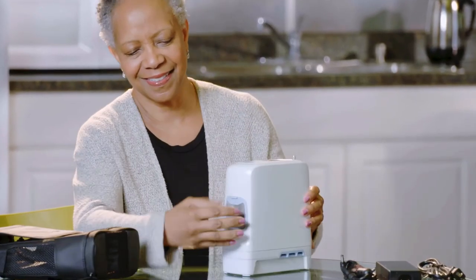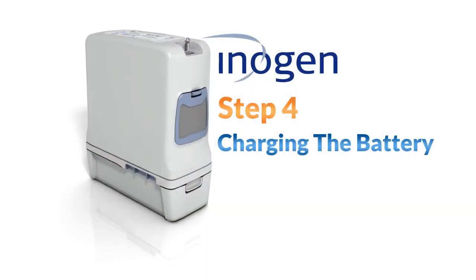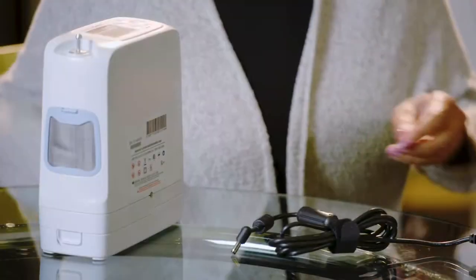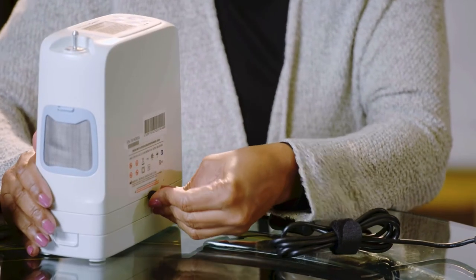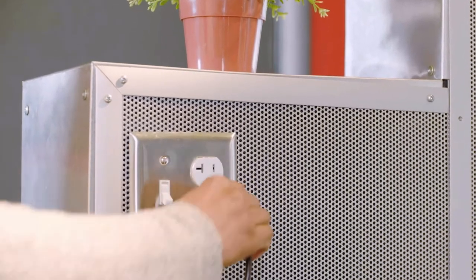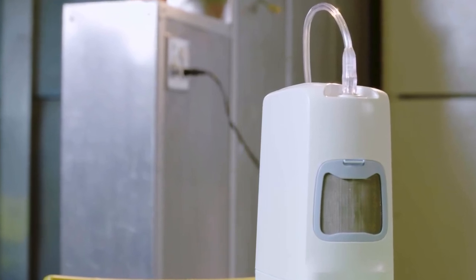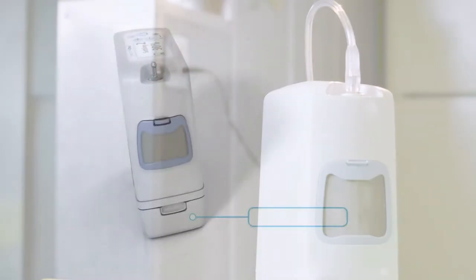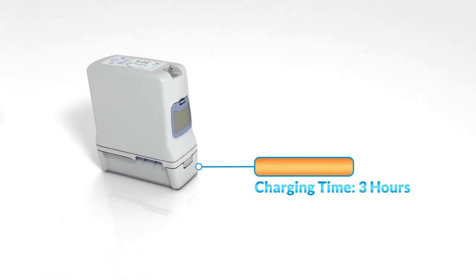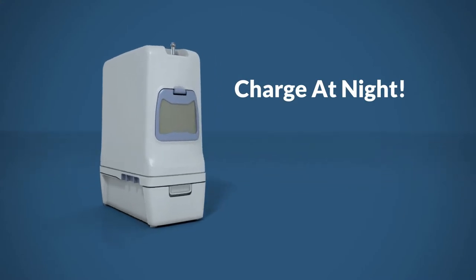It is important that you clean the particle filters weekly to ensure the ease of airflow. Plug the power adapter into the back of the G5 concentrator. Plug the AC power plug into the nearest electrical outlet. Whenever your Inogen 1 G5 is plugged in and a battery is attached, you're recharging the battery. An empty battery may take up to three hours to charge, but you don't have to wait for it to charge completely.